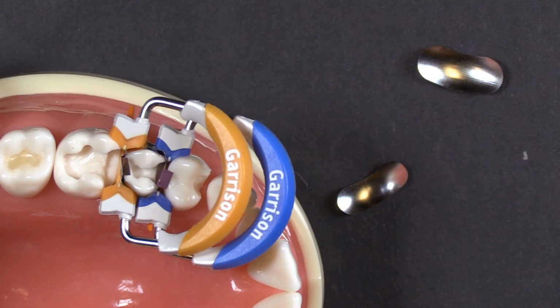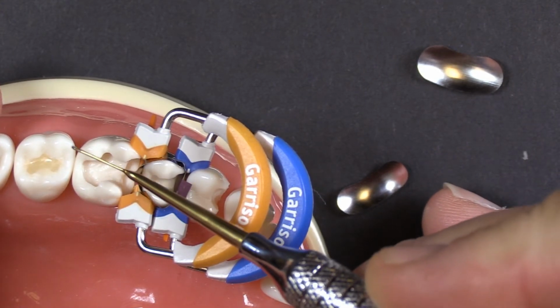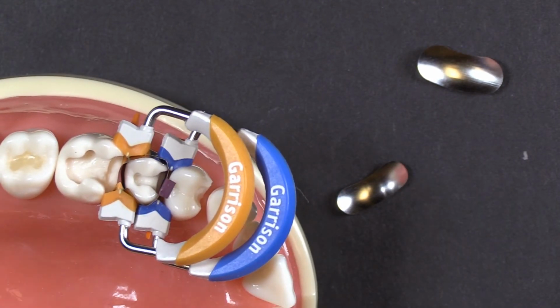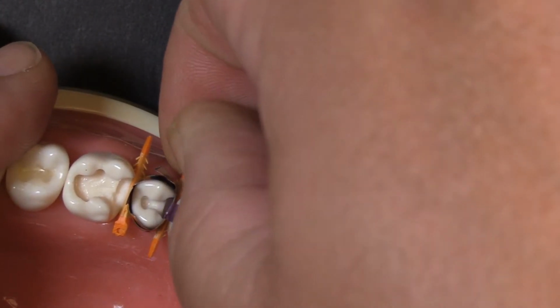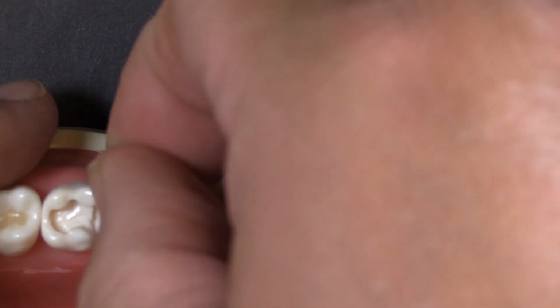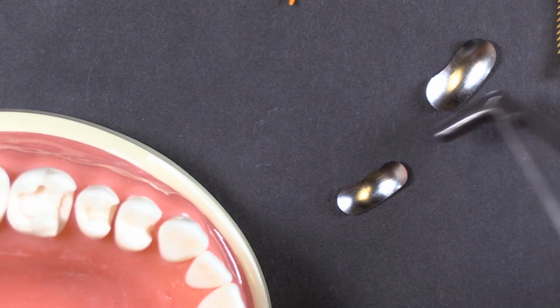Okay, there we go. So now we've got those two in place, and again, we're pretending that this was an MOD to show the issue with the overlap of the band. Now, alternatively, many of you have this in your office already, where you've got multiple systems from us or from other manufacturers. Generally speaking, if you go back to one of our older systems, the bands are going to be shorter. I'm going to pop this one in here so you can see how much shorter it is when it's in place.